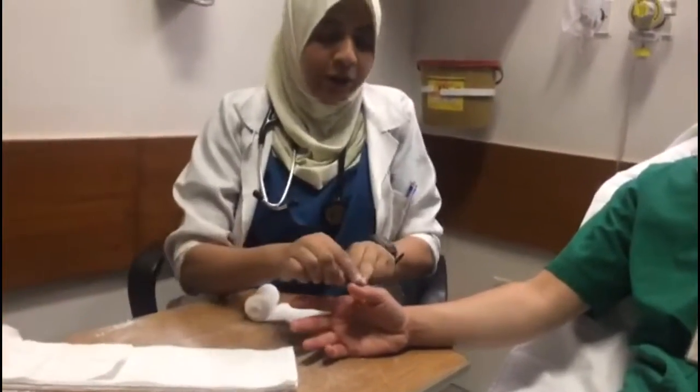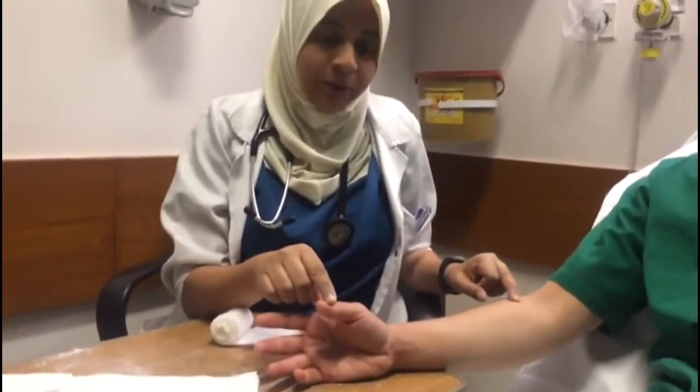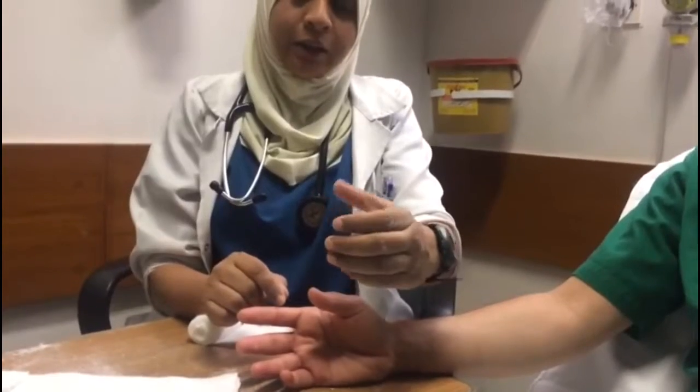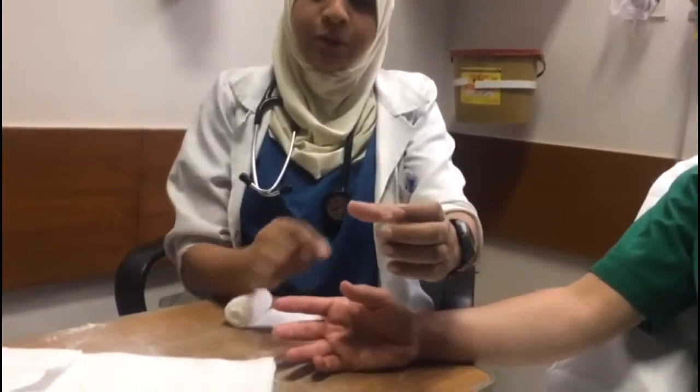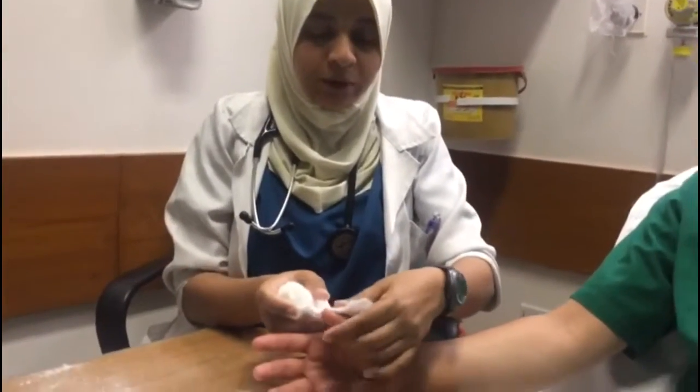First measure the splint from the thumb to the mid forearm. Many people advocate putting the thumb slightly up, but I prefer to keep it in a cup-holding position — it's a lot easier. A thumb spica immobilizes the wrist and the thumb.